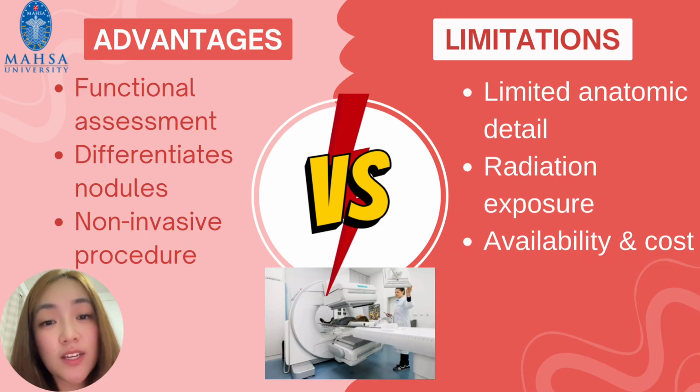So next, we are going to look into the advantages versus limitations of the thyroid scan in nuclear imaging. The advantages are functional assessment, differentiating nodules, and it is a non-invasive procedure. Meanwhile, the limitations: it has very limited anatomic detail compared to other modalities such as CT scan or MRI scan, and there is radiation exposure, and also availability and cost. So these are the limitations.